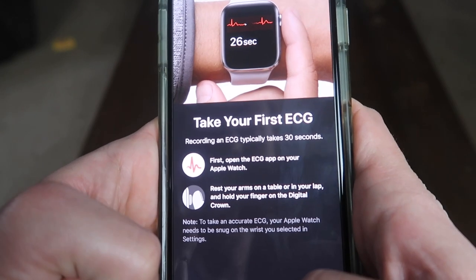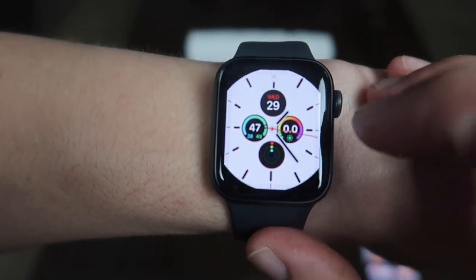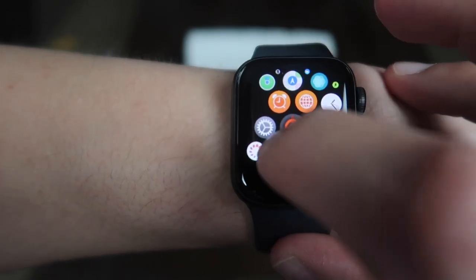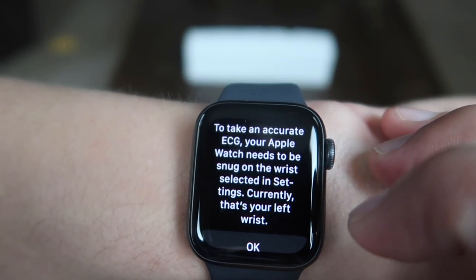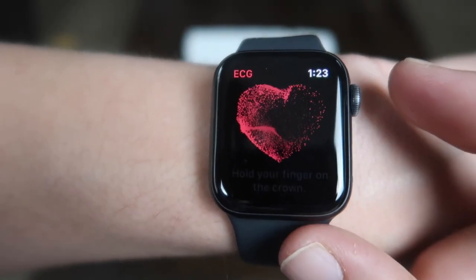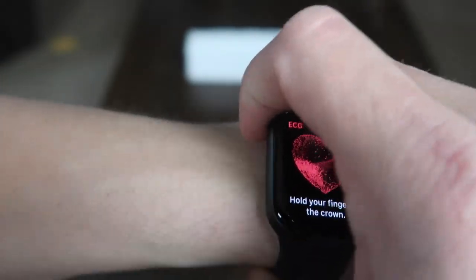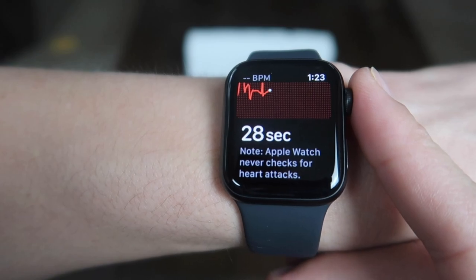Recording an EKG takes about 30 seconds. First, open the ECG app on your Apple Watch — so let's do that. Make sure your watch is snug on the wrist, selected in settings. Now it's going to ask me to hold my finger on the crown for 30 seconds.